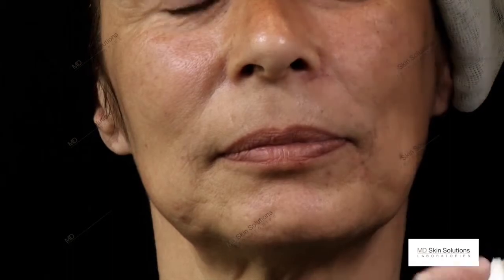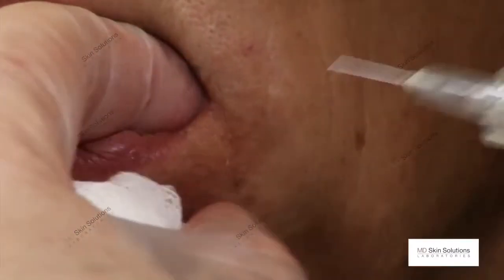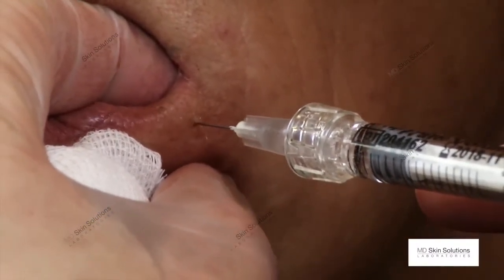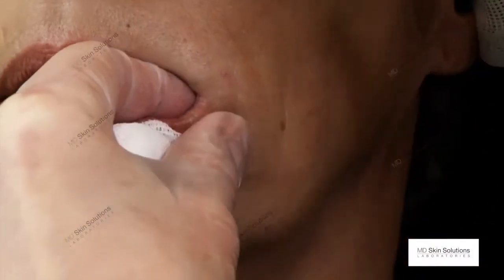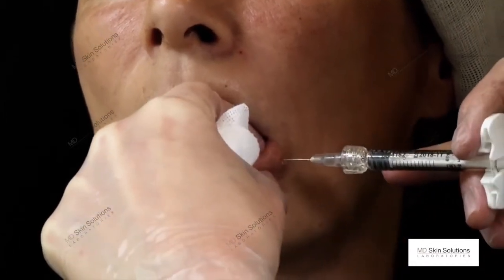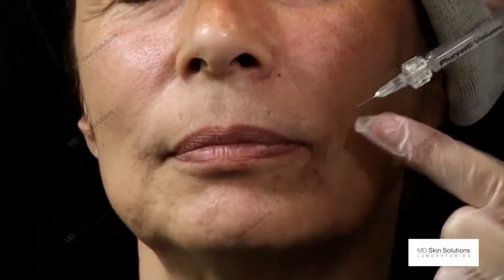The next area of injection will be the corner of the mouth and the prejowl area. The idea here is to put a bolus exactly in the corner of the mouth area to lift up. Okay? And it's a 0.1 of Pluryal volume. This was a subdermal injection.